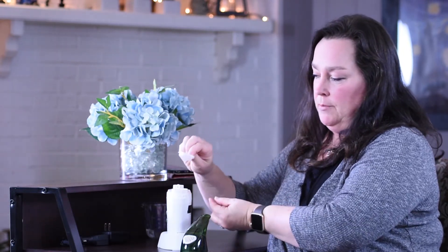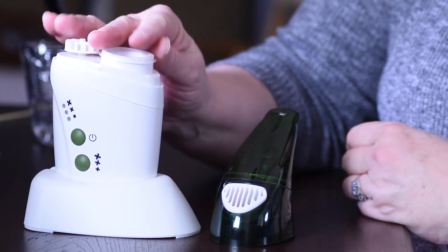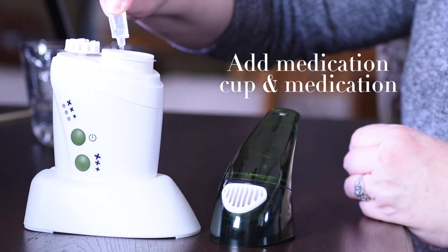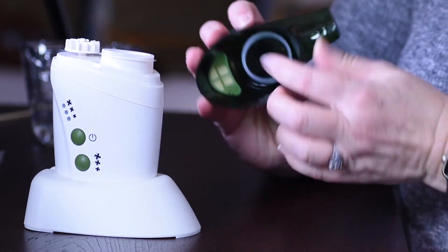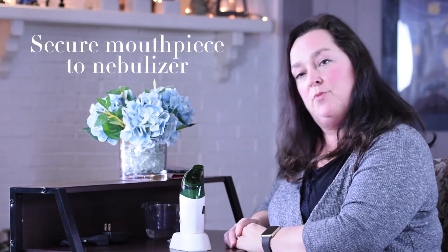There's also a medication cup that sits on top of the water reservoir where you can add your medication. Then you will take your mouthpiece and secure it to the top of the nebulizer and you're ready to go.